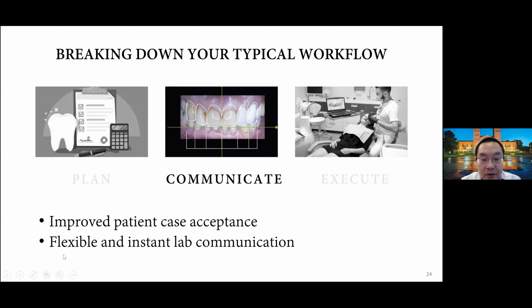And you can do flexible and more instant lab communications. You don't have to ship the lab models, impressions, and whatnot. Nowadays, everything is sent out digitally. It's much easier to communicate with the lab. You can change things along the way and update things. If you need more information, usually it's a little scan, and it streamlines the process a lot more.